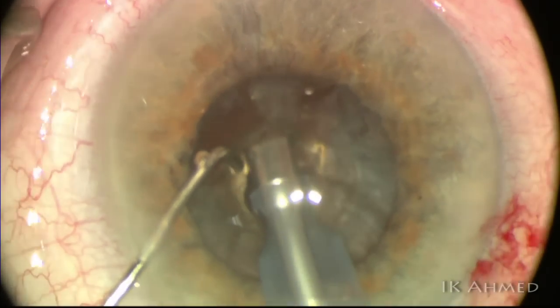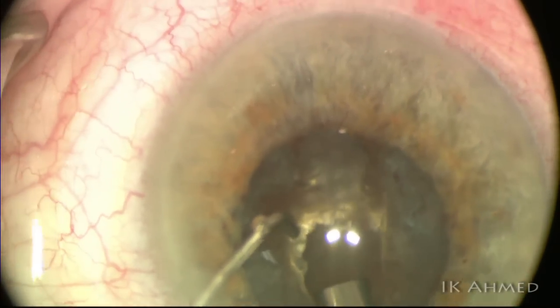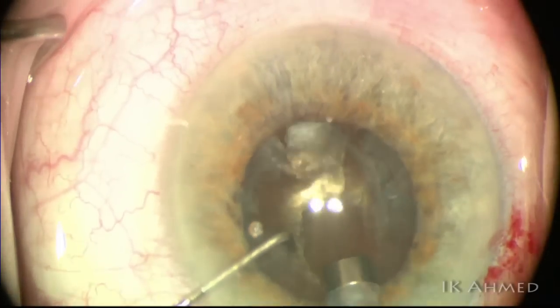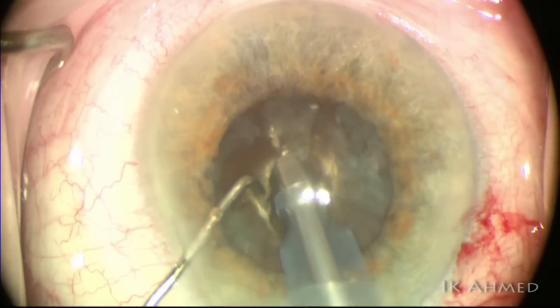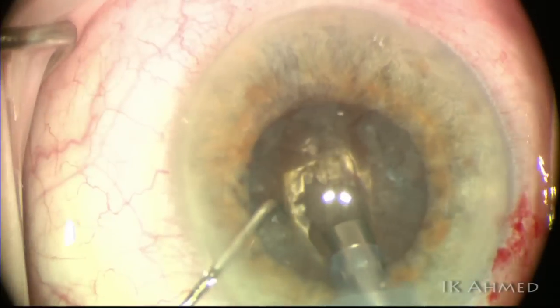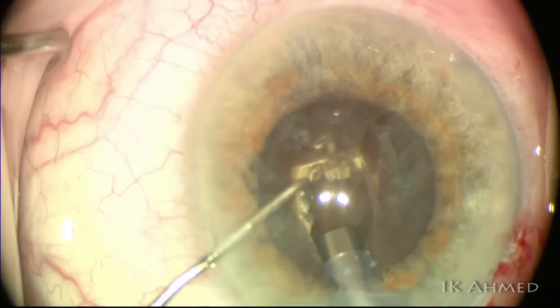Our approach in dealing with these dense cataracts is to create a very deep trough. A key point is to ensure we get deep down — basically 90-plus percent through — particularly in the central part of the nucleus, right down to near the posterior pole of the lens. It is not necessarily required in this technique to extend all the way peripherally, but really to get down deep centrally.